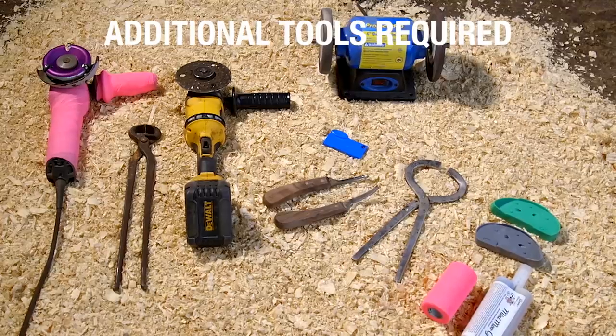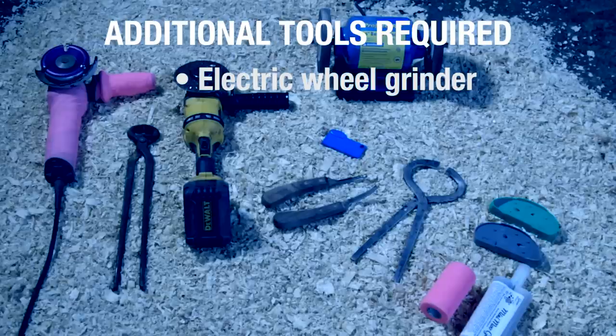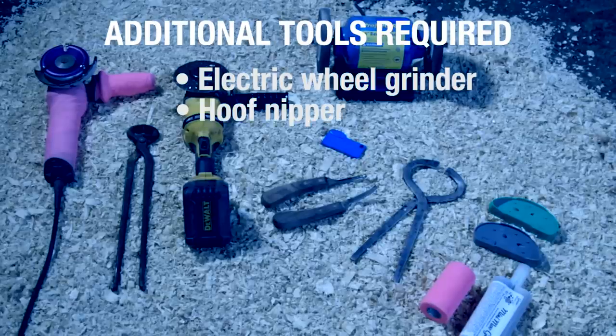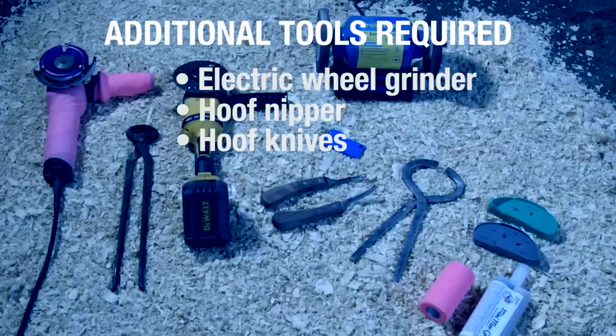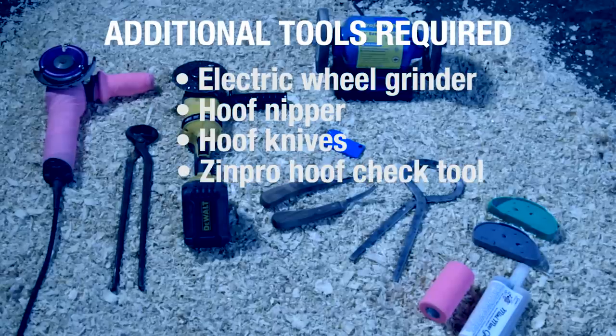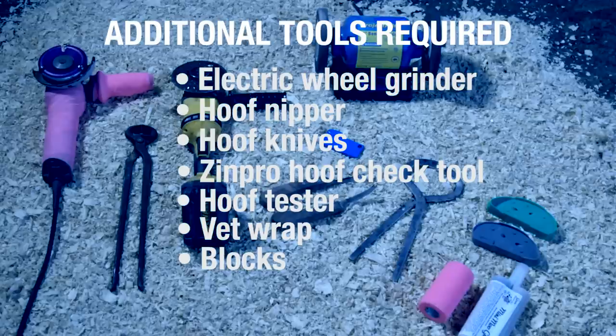Additional tools you will need include a chipper wheel or electric wheel grinder to help remove excess claw horn, hoof nipper, and hoof knives for modeling between the claws and for removing diseased tissue associated with claw lesions. You will also need the ZinPro Hoof Check Tool, hoof tester, Vet Wrap, blocks, and glue for adhering the blocks.